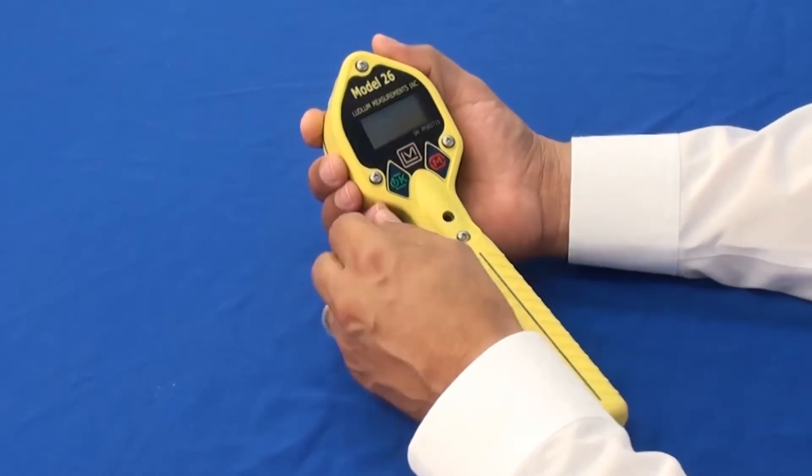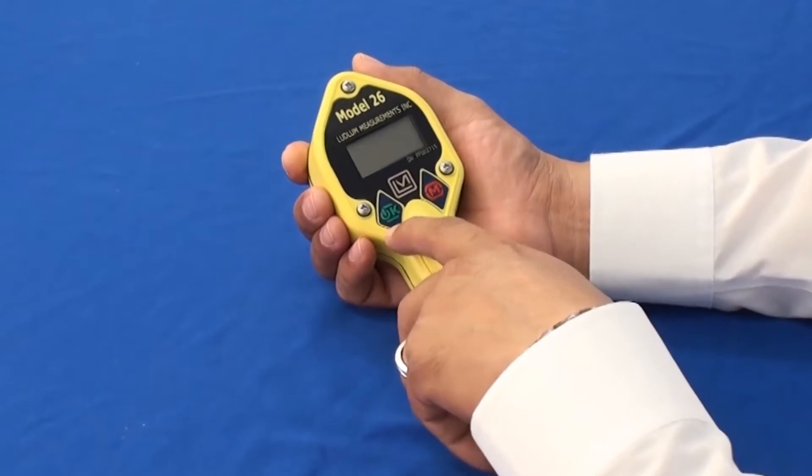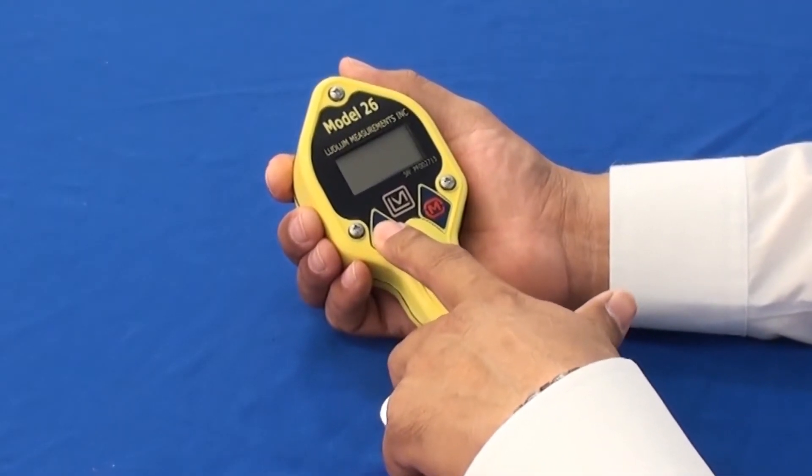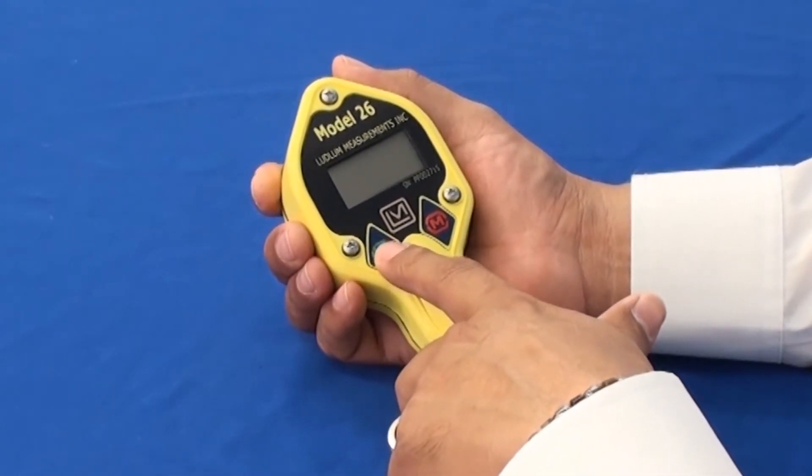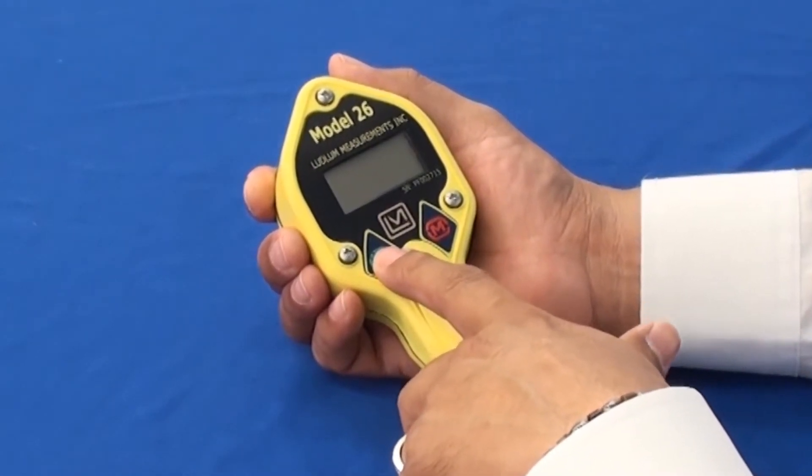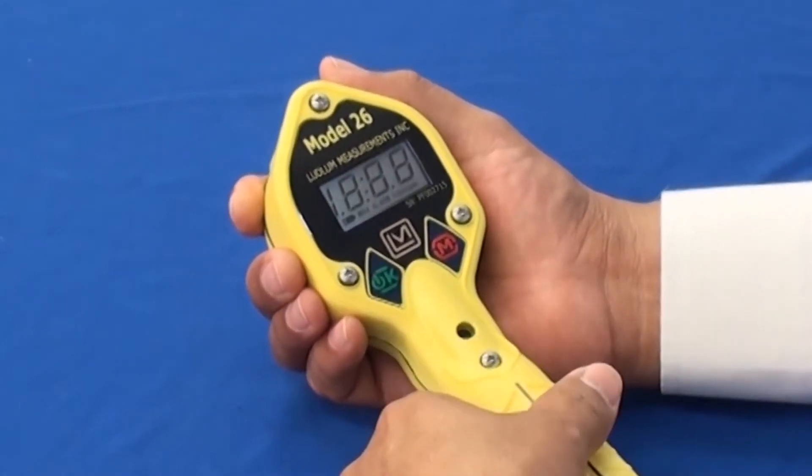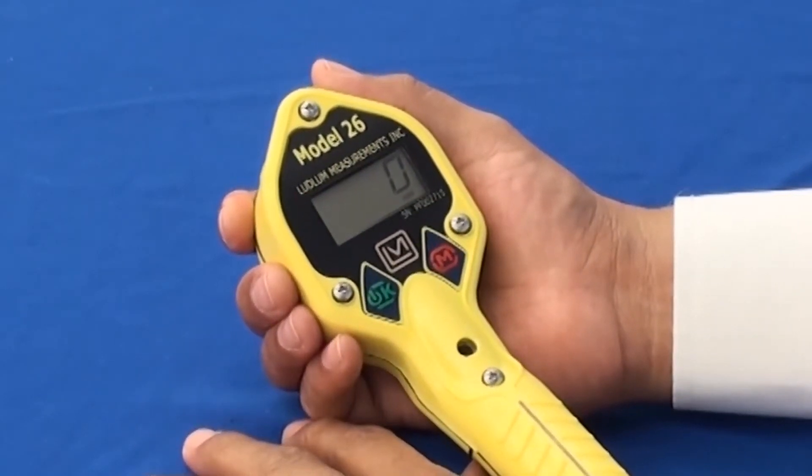Once again, here is the Model 26. All functions begin by pressing the power switch and releasing. Upon pressing the power switch, you will note all the segments in the display will light up and we'll finish showing you a three-digit firmware number and then it'll go to a normal display. 008 is the firmware number and now we're in normal display.